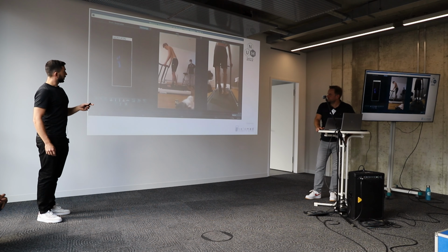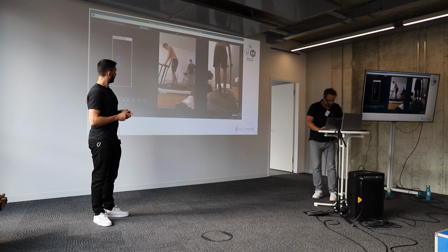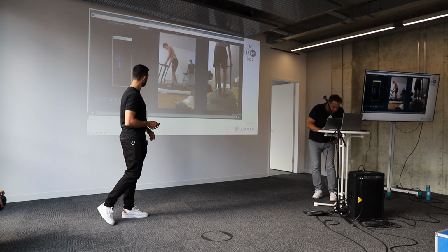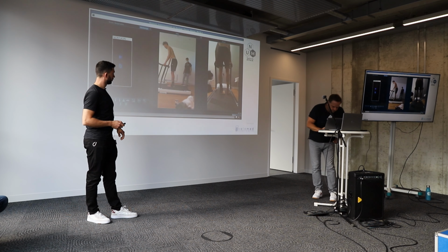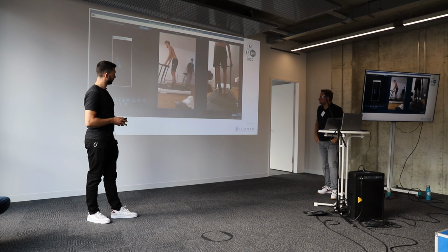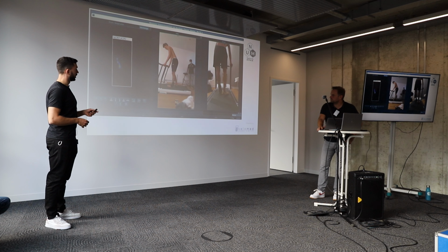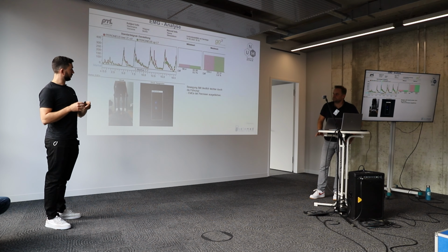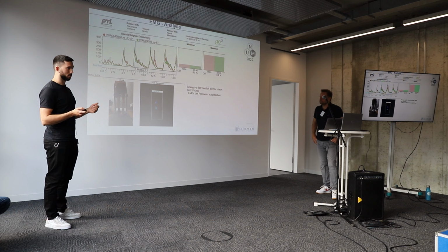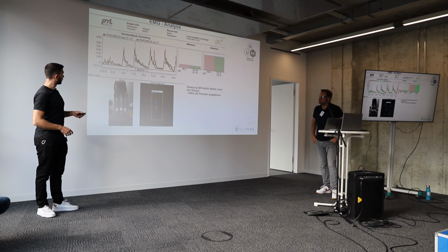And what was very interesting was then I tested it with a bandage, and the motion is pretty slow as well. Let's see, but better. So exactly the same testing protocol, so he feels more comfortable with this bandage. He also says he doesn't like it and he doesn't want to wear it in a game. He likes tape more. Yeah, every national basketballer is taped, so he's used to it.